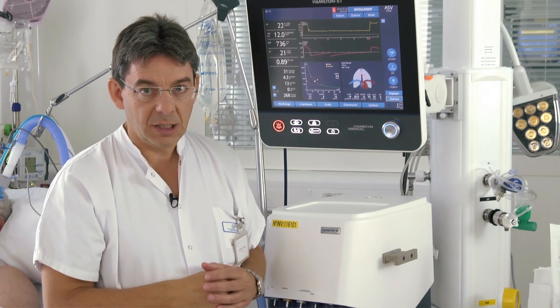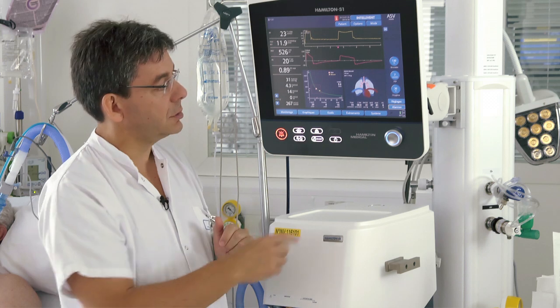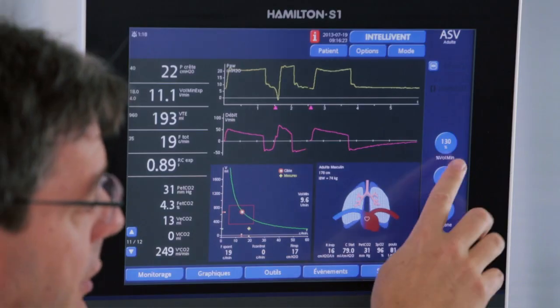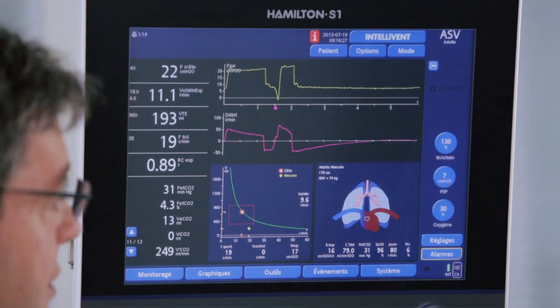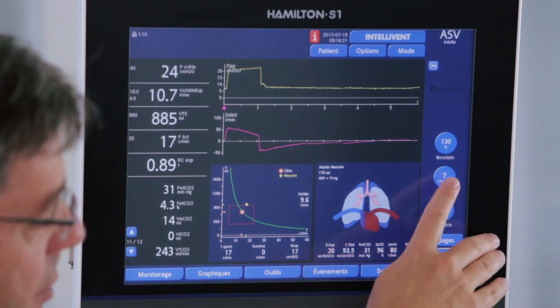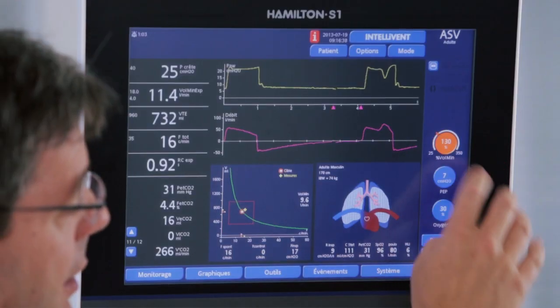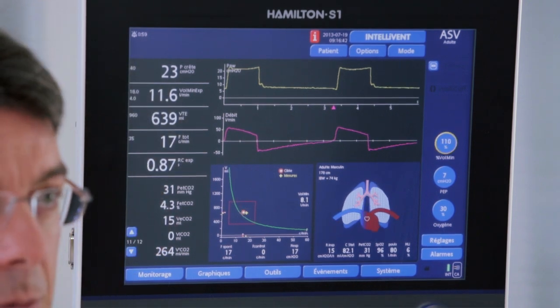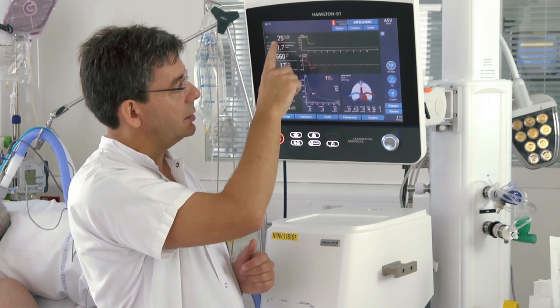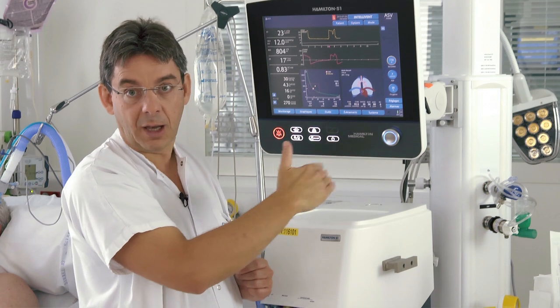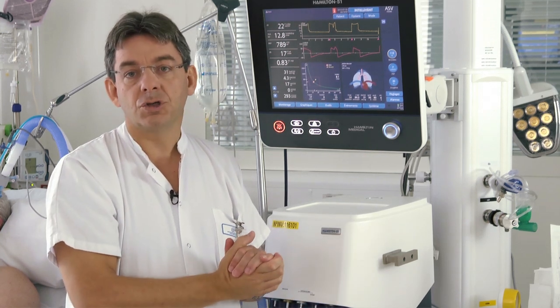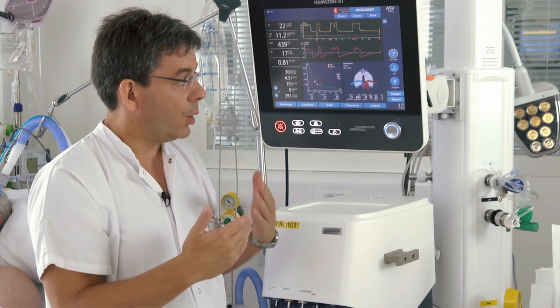When we want to wean with ASV, what we need to check is the pressure support actually being used for the patient. With a target minute volume of 130%, the pressure support is 24 minus 7, so 17 cmH2O. We can start weaning by decreasing the target minute volume, usually 20% at a time, and the pressure support will decrease accordingly. When the pressure support is below 16 cmH2O, we may proceed to a spontaneous breathing trial, which can be done either in pressure support or in ASV.